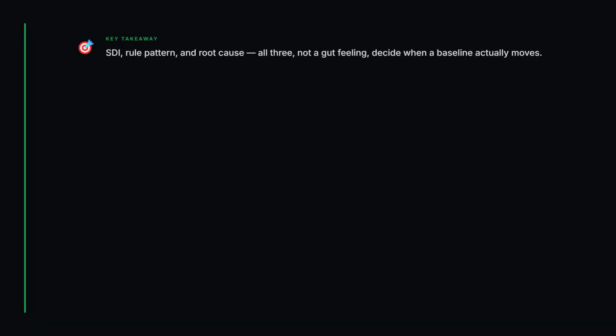Root cause investigation tells you why. Only all three together, not a gut feeling about a chart that's been flagging too much, justify actually moving the baseline. Let's walk one QC lot through its entire life cycle, start to finish, with real numbers at every step.